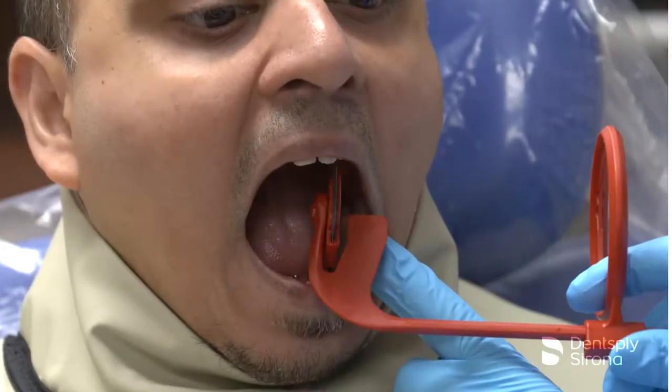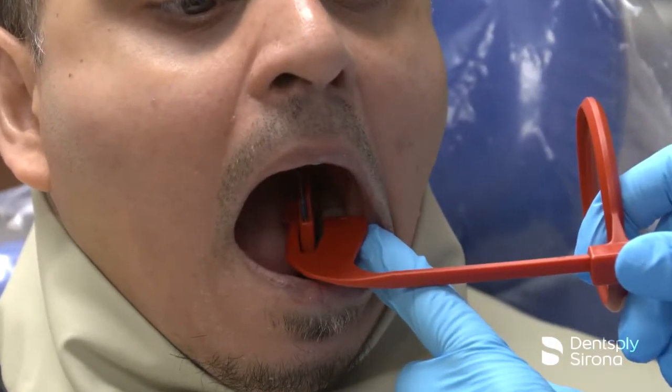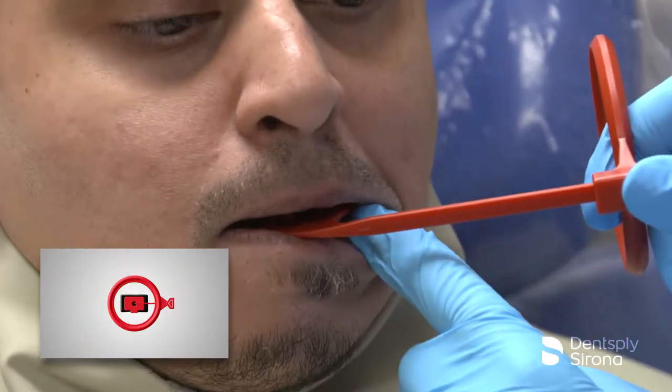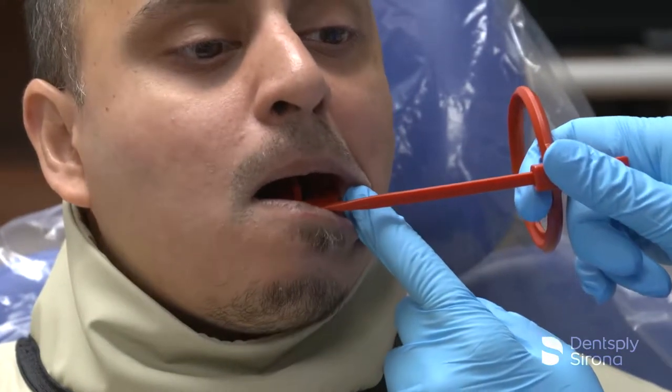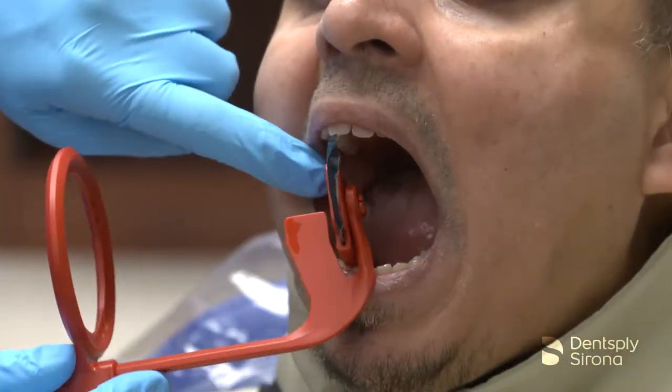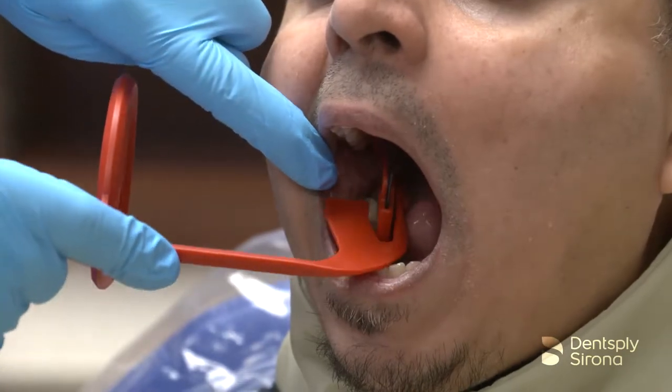After the imaging plate is loaded into the protective cover, rotate the media holder to the desired horizontal or vertical position depending on the type of bitewing image needed. Ensure that the bite block with the image receptor is centered within the aiming ring.